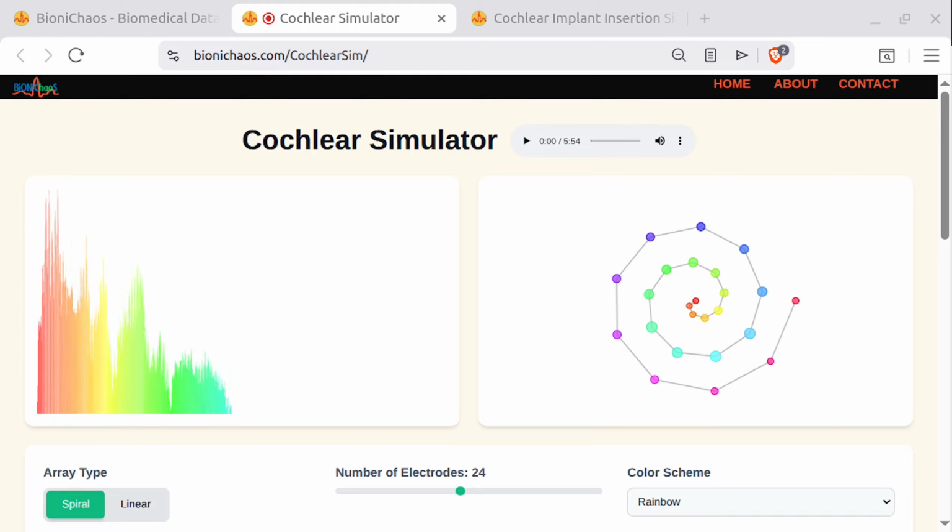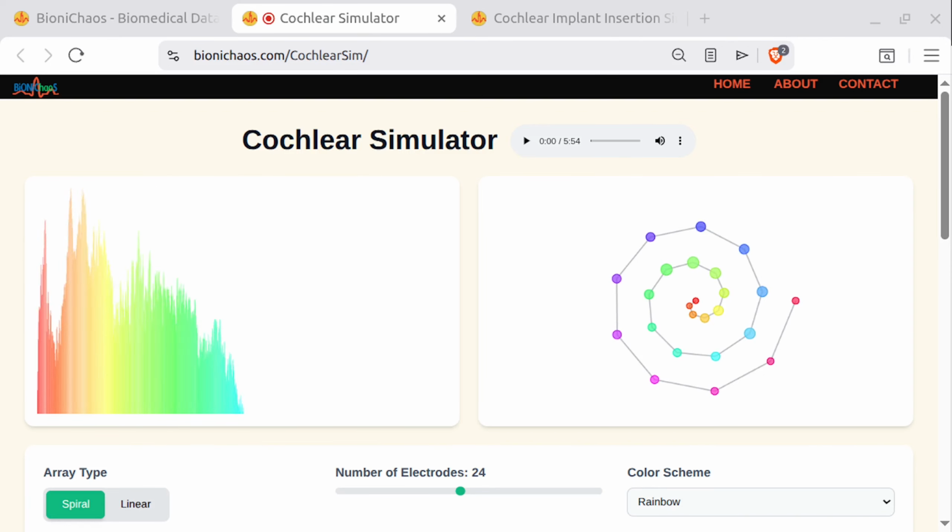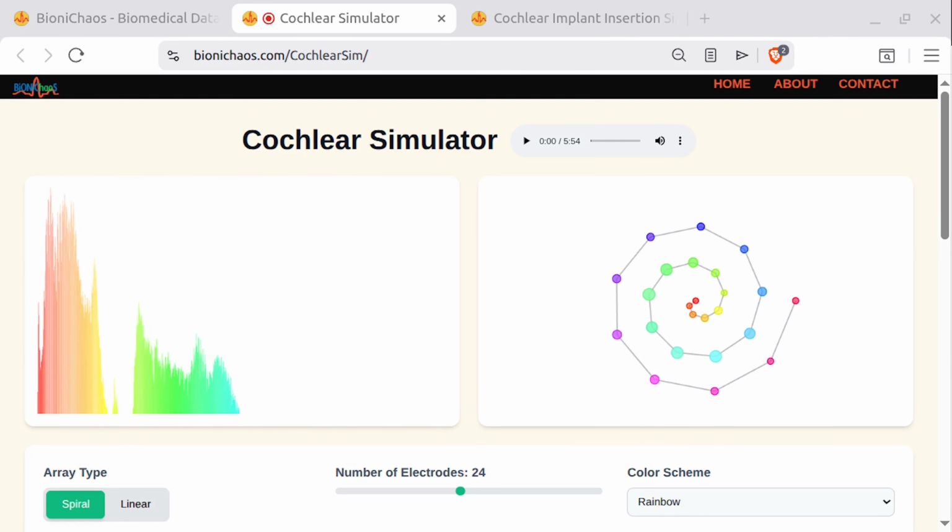Yes. Newer implant models like the Nucleus Profile Plus and the OSIA OSI 300 are specifically designed to be MRI-conditional. We've redesigned the internal magnets so they can freely rotate within their titanium casings. Oh, I read about those. Exactly. This allows a patient to safely undergo a powerful 3 Tesla MRI with the internal magnet safely left in place. No surgery required whatsoever.